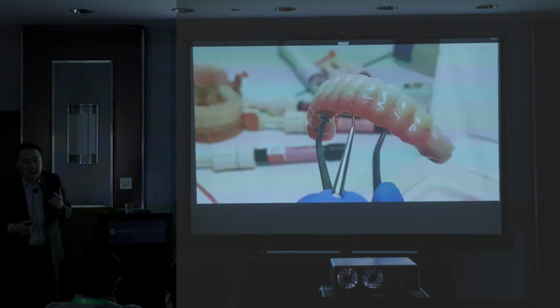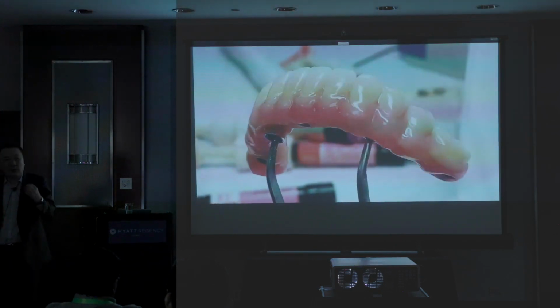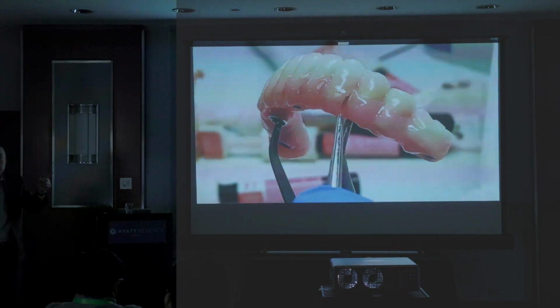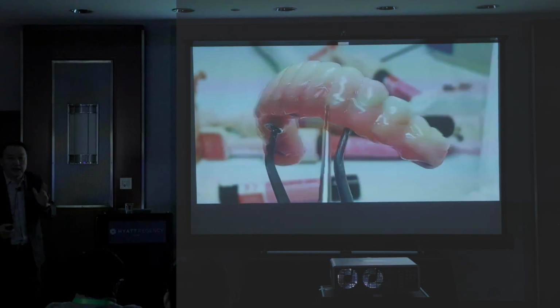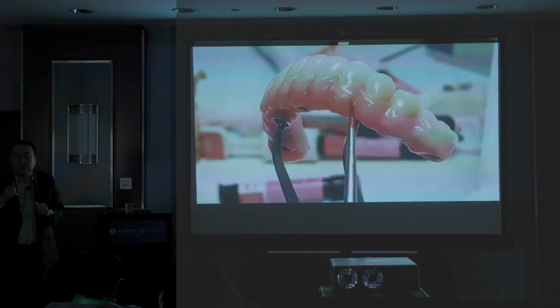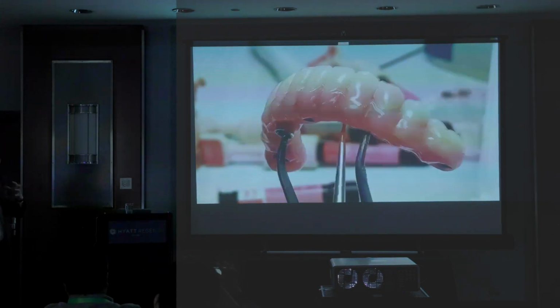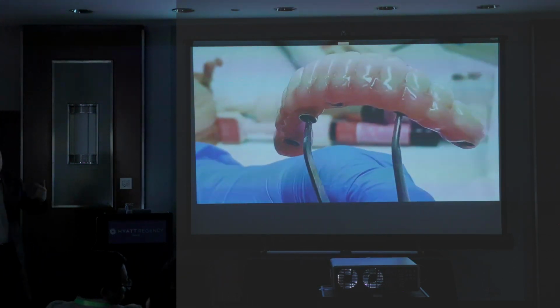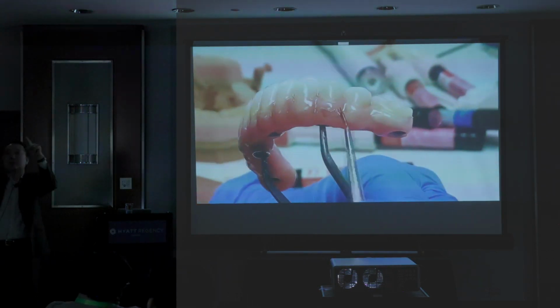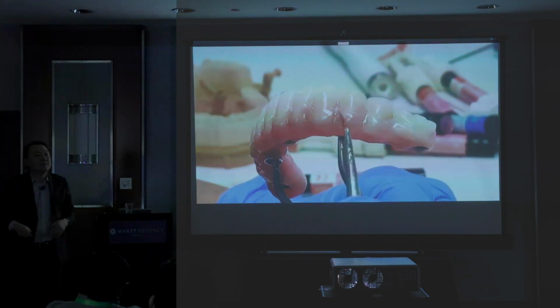Here's the secret. I talk to dental guys all the time. Do not follow exactly what the doctor said about tissue color; use a light tissue color for me. Then I can paint. The problem is whenever they already do a good tissue color, it does not match with the ceramic. So then I'm puzzled, because this is one patient, right? One patient. I have to match it off.